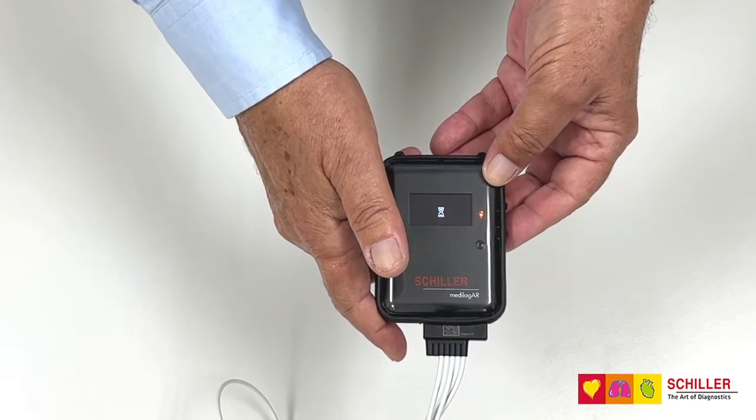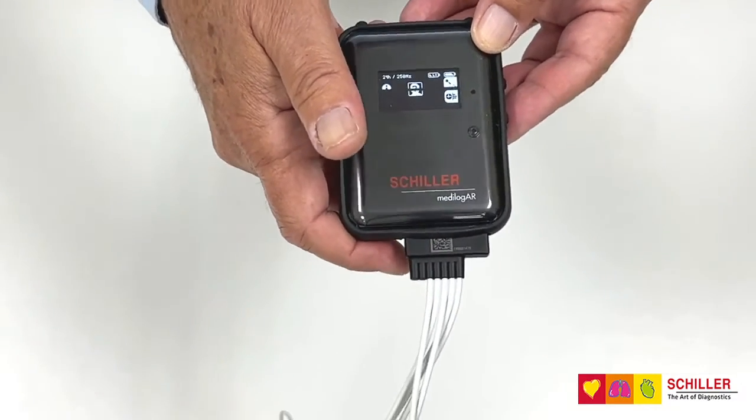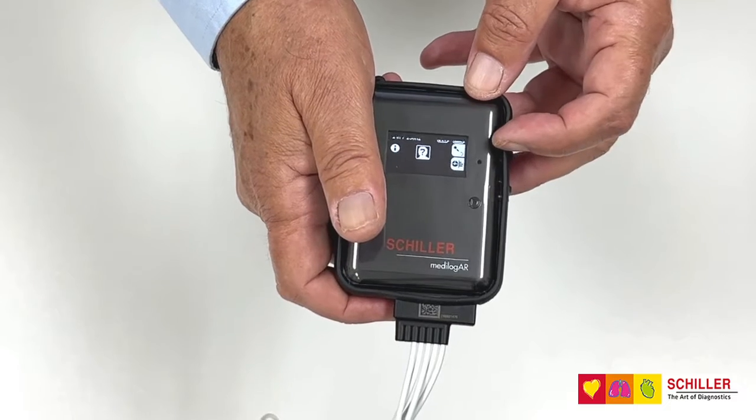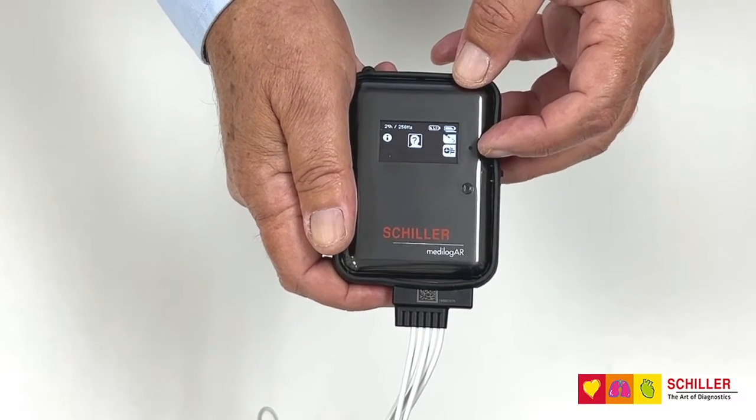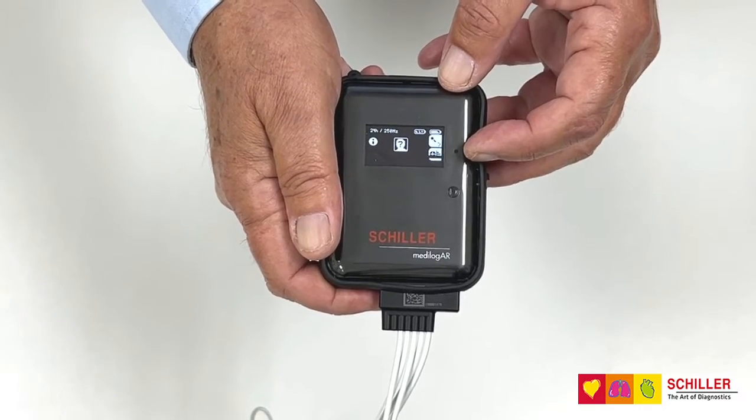At this moment the recorder is on. You have two options: the upper button is for recording the patient ID, and the lower button to check the signal quality.